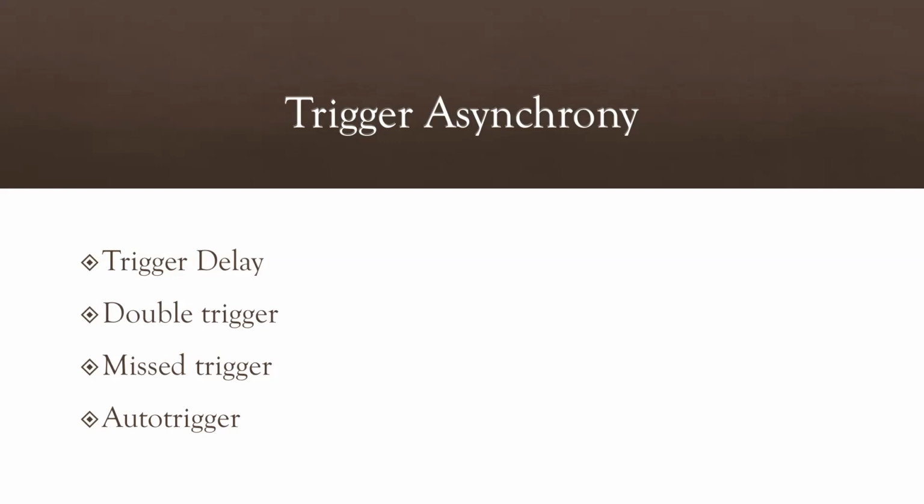Do I put all this in the chat or is it sounding familiar? Okay. Yeah, for trigger delay with air trapping or auto PEEP, the patient's effort is not noticed by the ventilator.